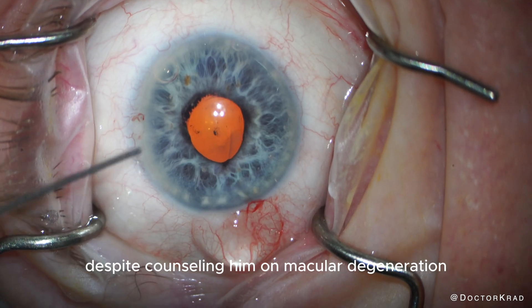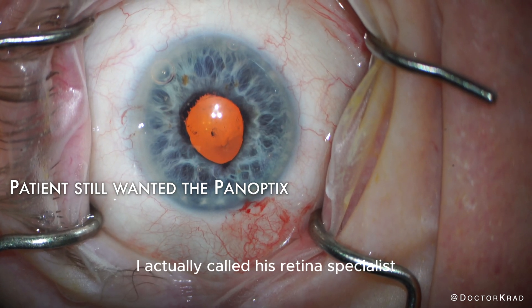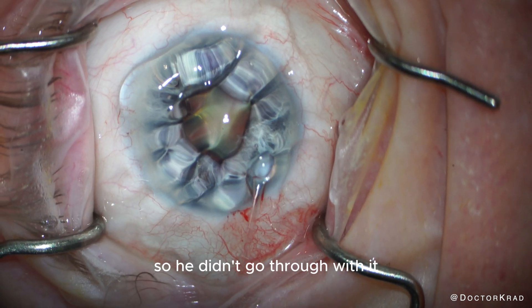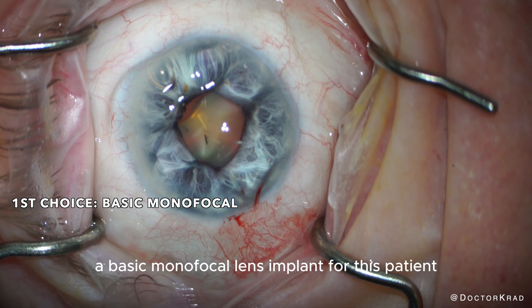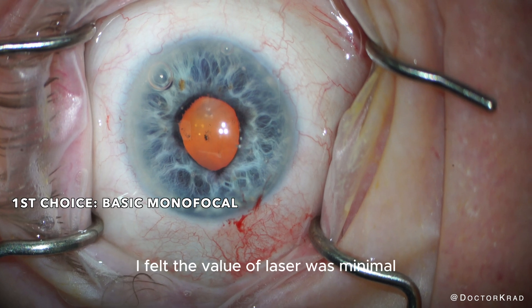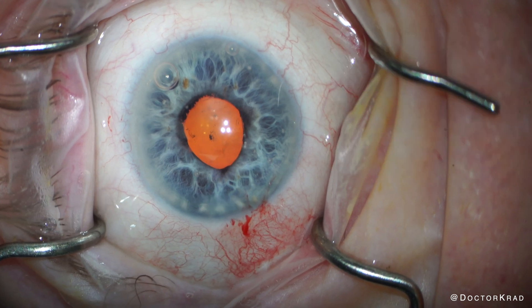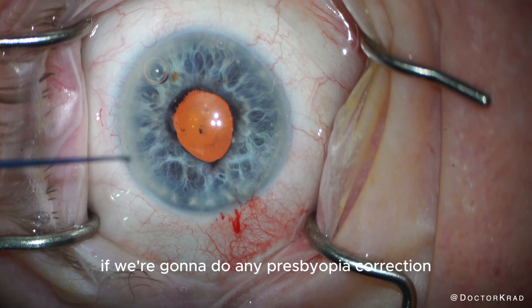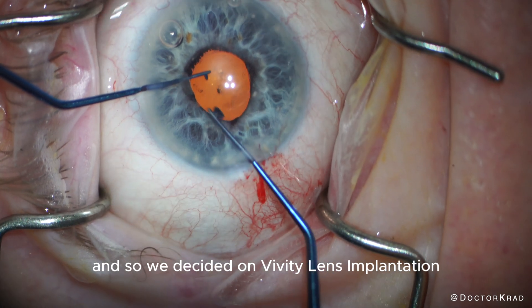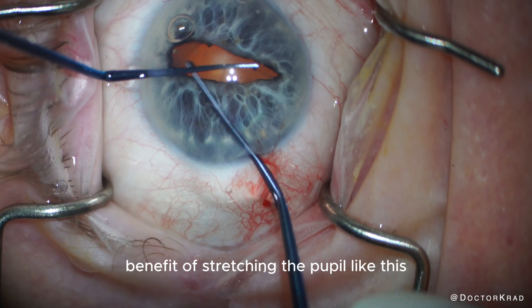This patient, despite counseling him on macular degeneration and limited best corrective visual acuity, still wanted the Panoptix. I wasn't comfortable doing that. I called his retina specialist and found out they had recommended an injection for treating his macular disease, but the patient was uncomfortable with it and didn't go through with it. I recommended a basic monofocal lens implant as my first choice. With a small and irregular pupil, I felt the value of laser was minimal — at most, one can perform LRIs, and this patient didn't have significant astigmatism. I spoke with his retina specialist and we decided that if we're going to do any presbyopia correction, the most we would offer is an EDOF lens — an extended depth of focus lens. So we decided on Vividy lens implantation. With the Vividy lens, you don't want the pupil to be too small or you'll get more myopia than you expect, so that's another benefit of stretching the pupil.